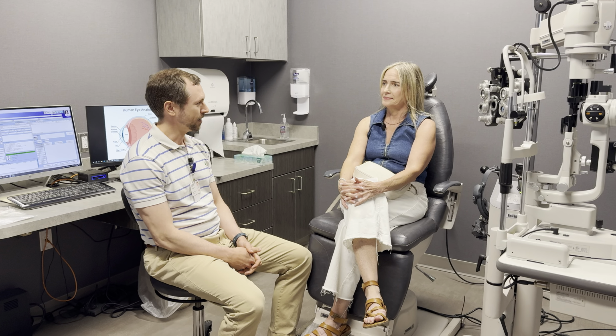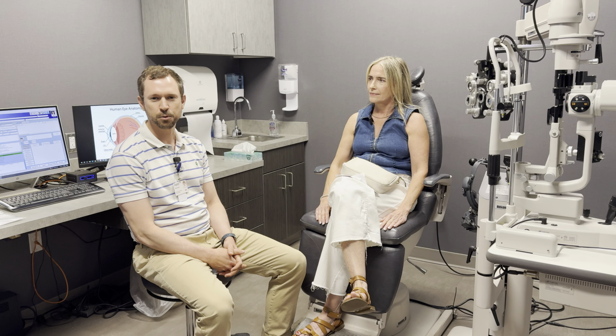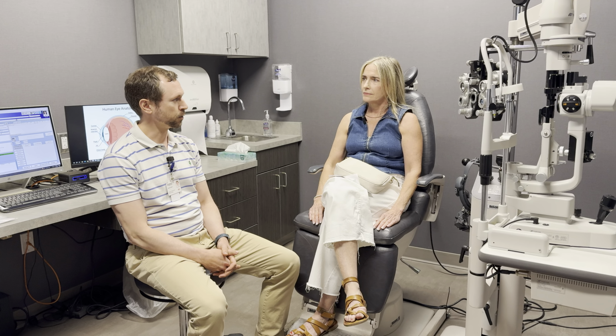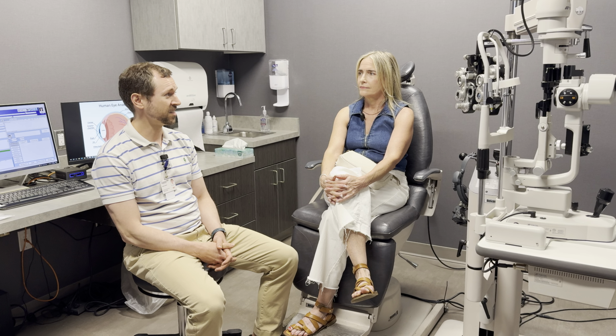Right. Which conventional wisdom, I think it would be fair to say, a lot of doctors would discourage multifocals in RK patients, or even blanket across the board rule it out. And in fact, I would describe myself as even being relatively conservative with RK patients getting multifocals. But this patient has done awesome.